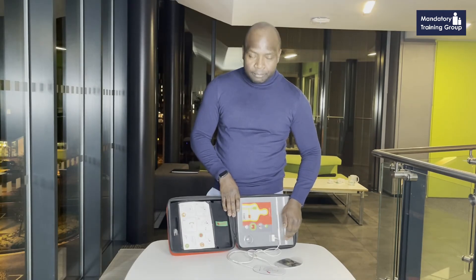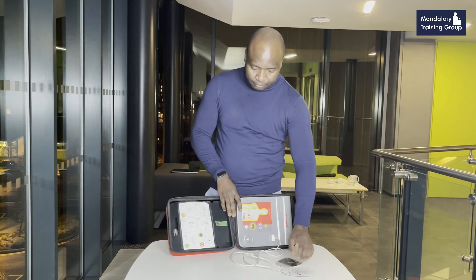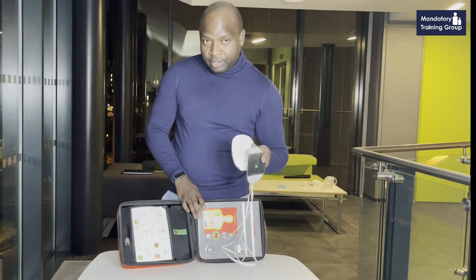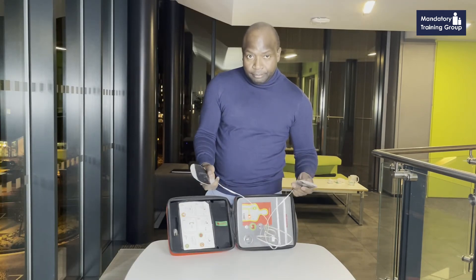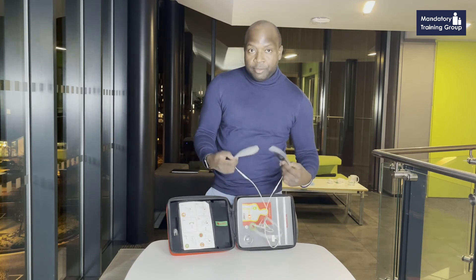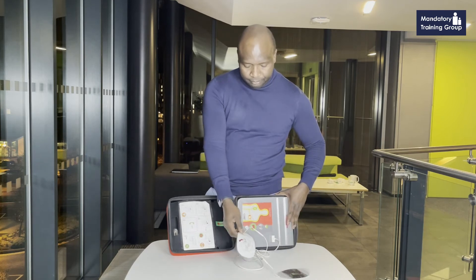Open patient's airway. Phone alarm number. If there are no signs of life, remove clothing from chest and stick on electrodes — these are the electrodes it's talking about, already attached to the AED itself. Stick electrodes on the patient's bare chest. Once they are on, it will notice and give you further instructions.